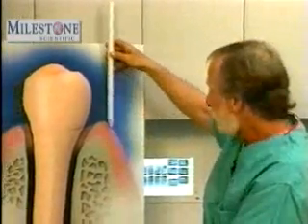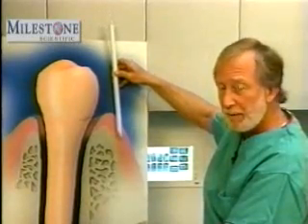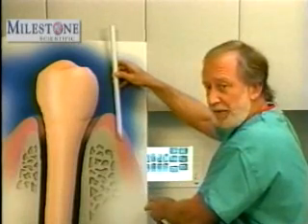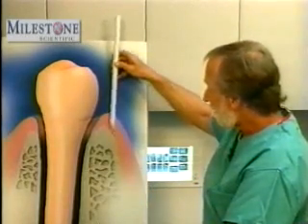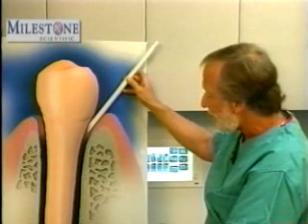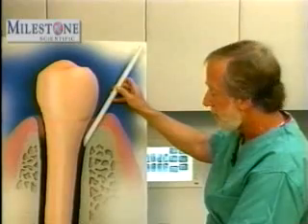I see blanching going all the way down to the floor of the mouth. Again, I don't have pulpal anesthesia. In this situation, the needle is likely to be lingual aspect to the alveolar bone, and the anesthetic is in fact diffusing into the floor of the mouth. To correct this, advance the needle along the tooth. Keep the bevel along the tooth and slide it again into the PDL before depositing the anesthetic.